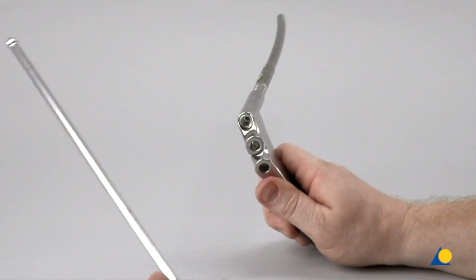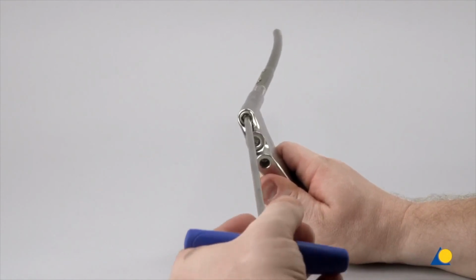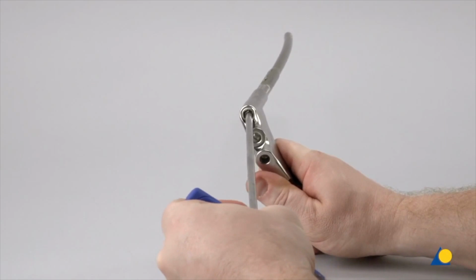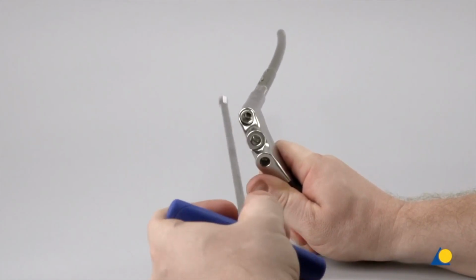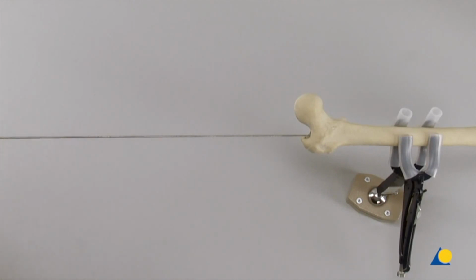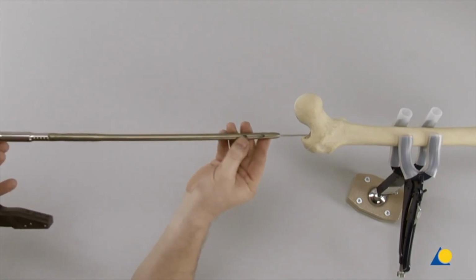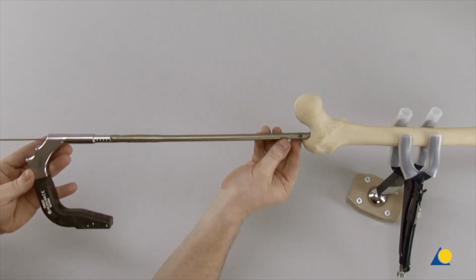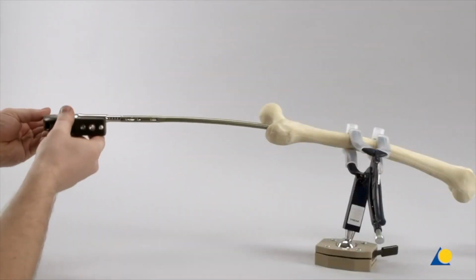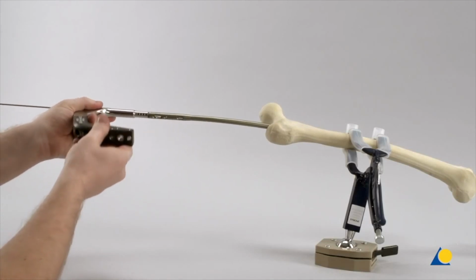The T-handle hexagonal screwdriver with spherical head is inserted into the insertion handle and turned clockwise to securely tighten the nail to the connecting screw. The nail is manually inserted over the reaming rod and into the medullary canal as far as possible. Note that all retrograde and antegrade femoral nails can be inserted over reaming rods. Slight twisting motions assist the advance of the nail into the medullary canal.